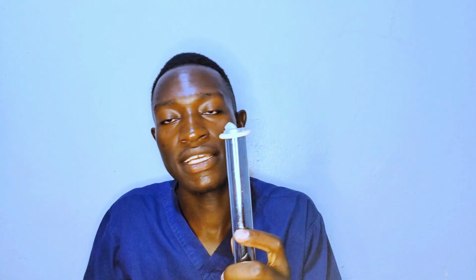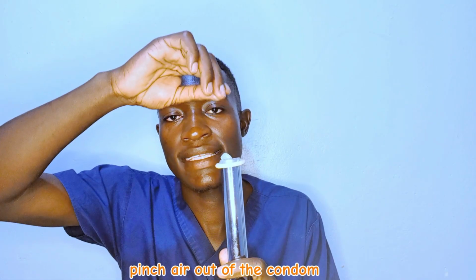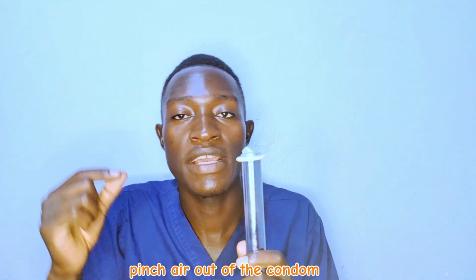So just place it at the head of the penis. Next, you need to pinch out excess air. If you have been placing it and you find that it has some excess air, you need to pinch out some air from this tip. And you should also leave some space. You should not just pinch and remove everything. You should leave some space.